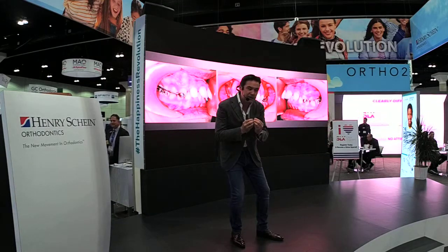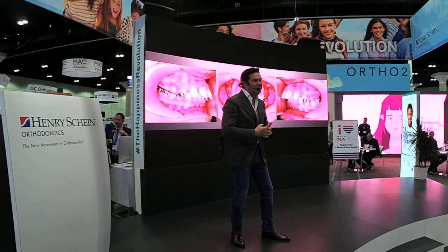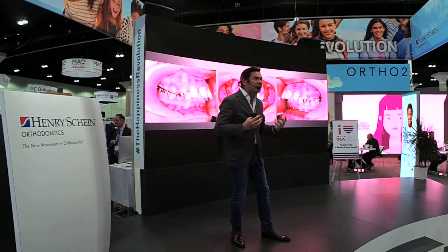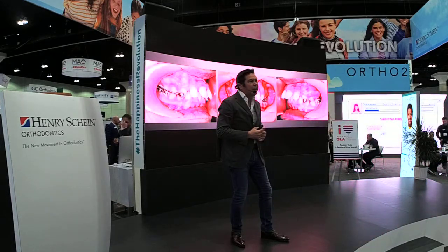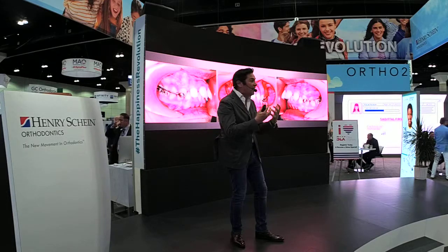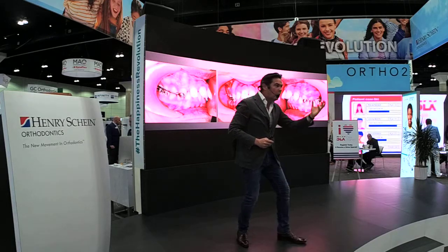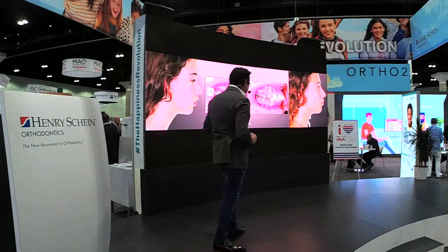This is the difference. When we are working in the office, when we are having complex cases and patients want a system that is without braces, with aligners, the question is, can we approach almost every case with them? If we hybridize, if we use technology outside of the aligner, yes, we can. So we have the motion that will help us in the correction of the sagittal relation on this particular case.